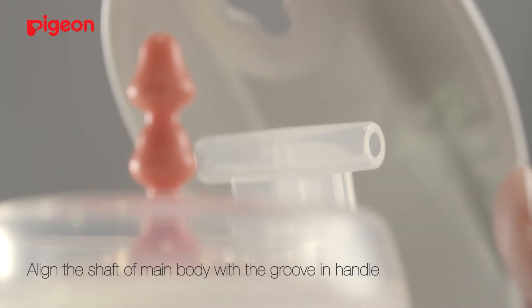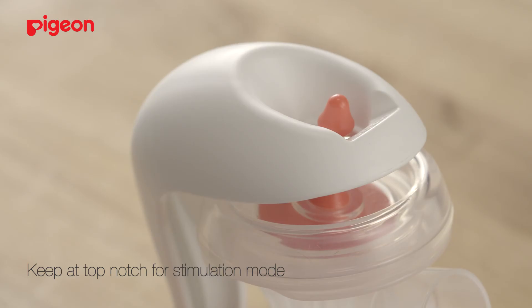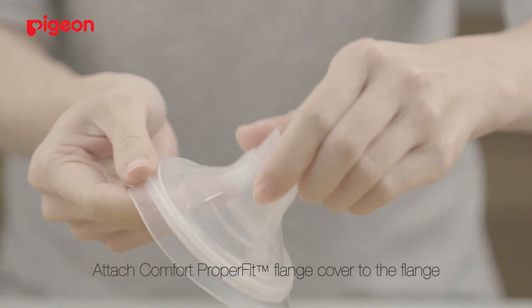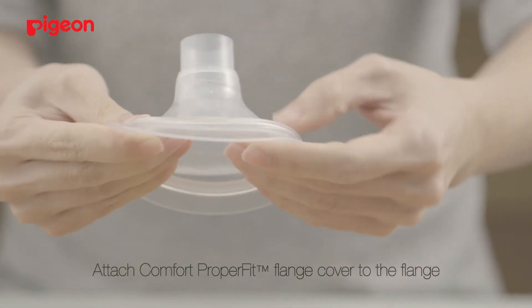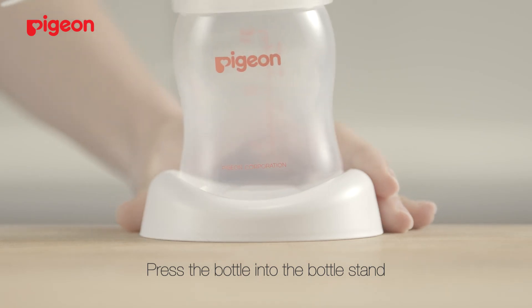Align the shaft of the main body with the groove in the handle. Push until you hear it click. Keep at top notch for stimulation mode. Press the push part at the tip of the handle for expression mode. Attach the Comfort ProperFit flange cover to the flange and attach them to the main body. Press the bottle into the bottle stand.